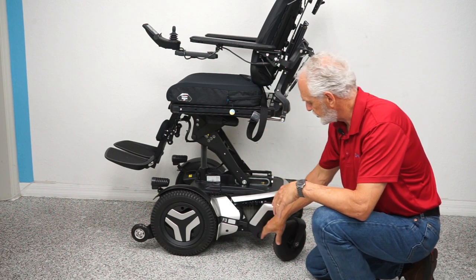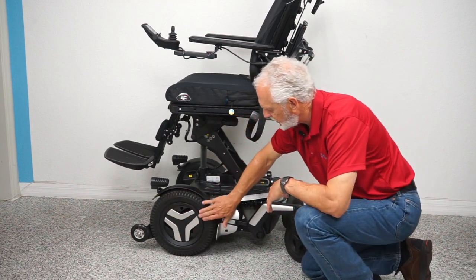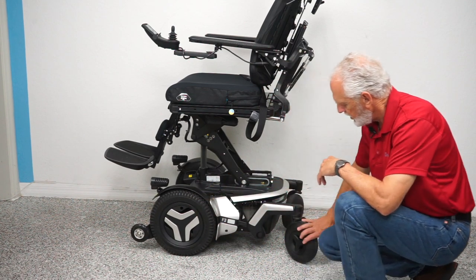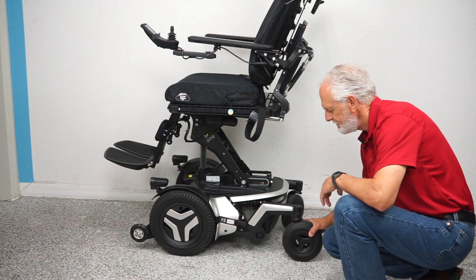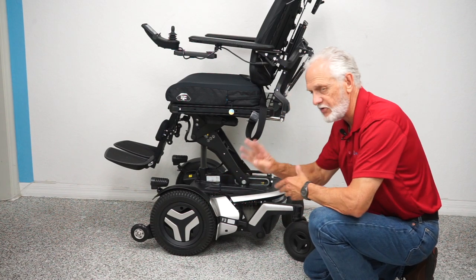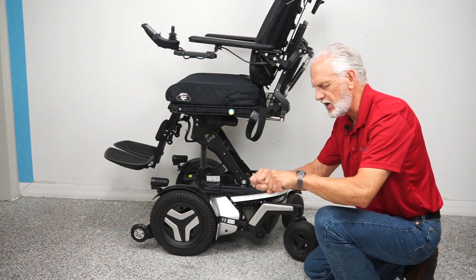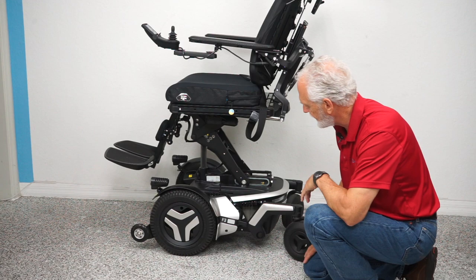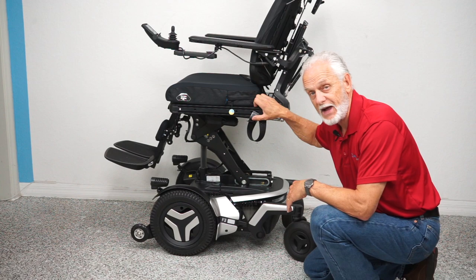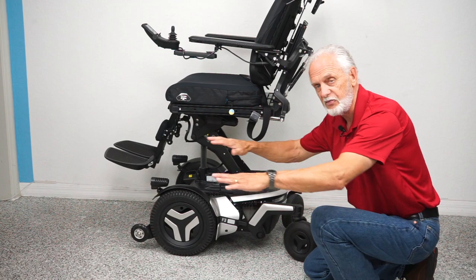We call these the Rolex of wheelchairs. Looking at the base: we have a 14-inch solid tire that will not mark your floor. There's a little tip wheel in the front off the ground, and nice solid 8-inch caster wheels in the back. You can see the shocks — there are four of them, adjustable by turning the ring. You can make the shock tighter or looser depending on what kind of suspension you want. That's why this chair weighs about 425 pounds, and with this suspension you get a really smooth ride.